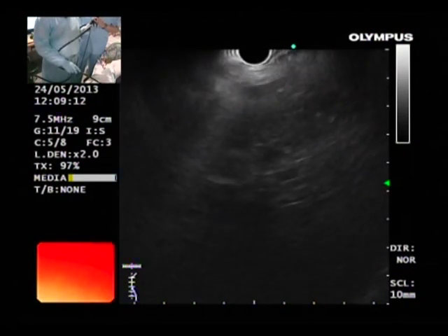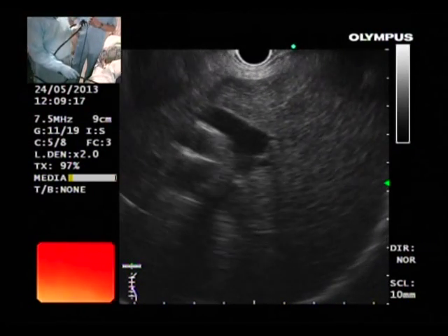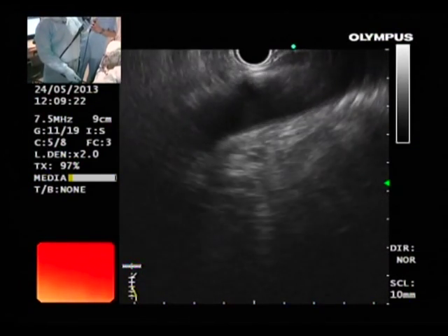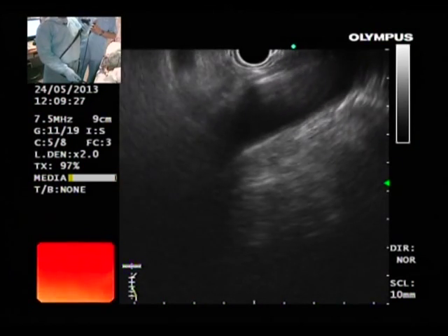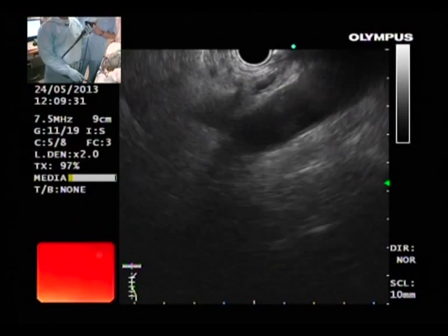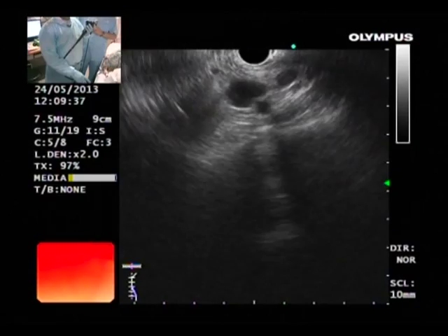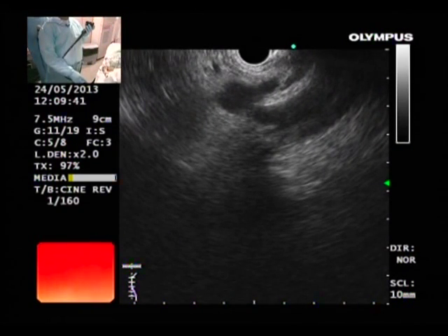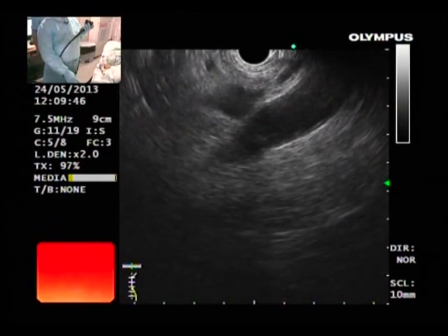Coming back to the liver — this is the hilum. The liver is anterior and I want to go to the aorta. All I have to do is turn posterior. So I have turned clockwise and I am at the aorta. Now we have to find the celiac axis. We follow it there — so this is the celiac axis. Can you make it a bit bigger?